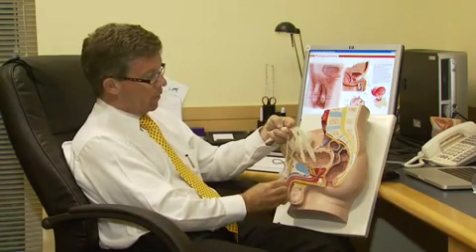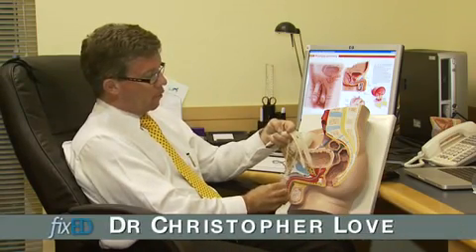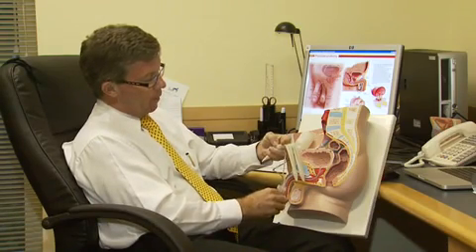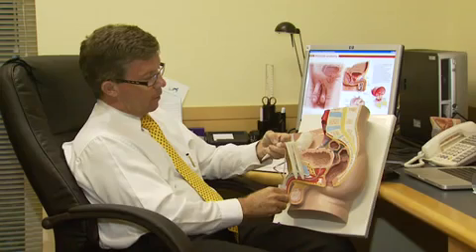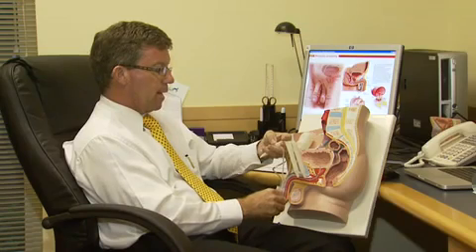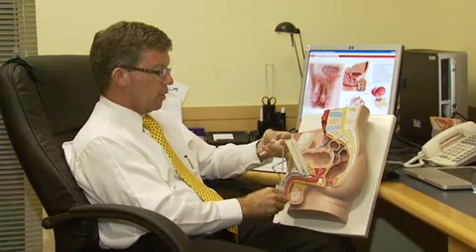He feels the pump and presses on it, and that starts transferring the water from the reservoir inside his body through into the cylinders which are inside the penis. As he pumps, the cylinders fill up with water and because they're inside the penis it really starts to look like a completely normal erection.